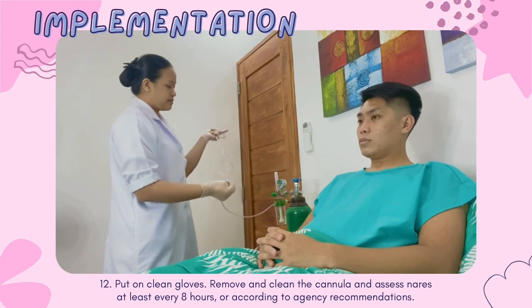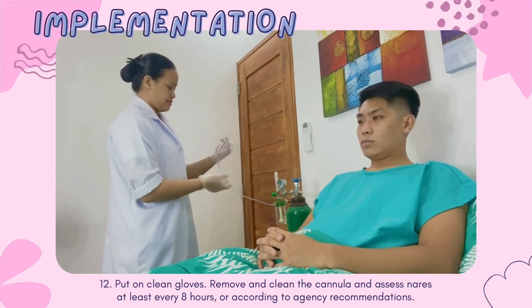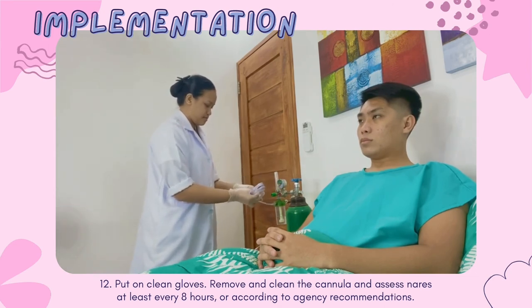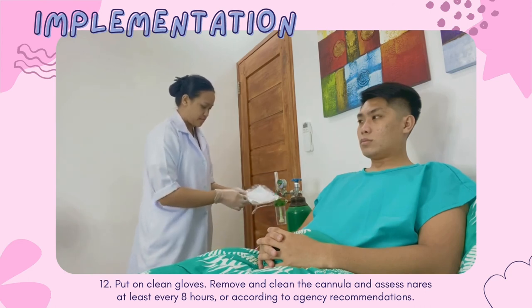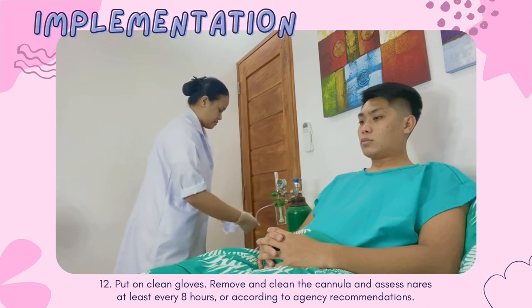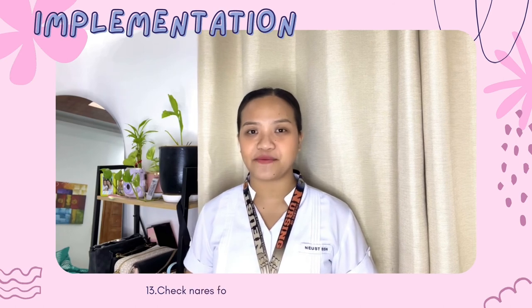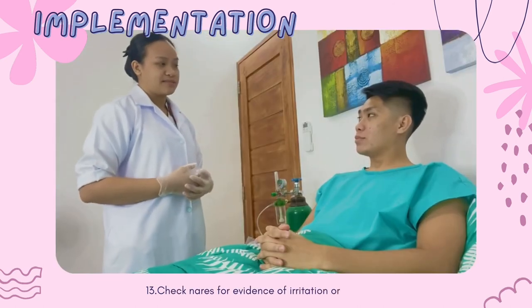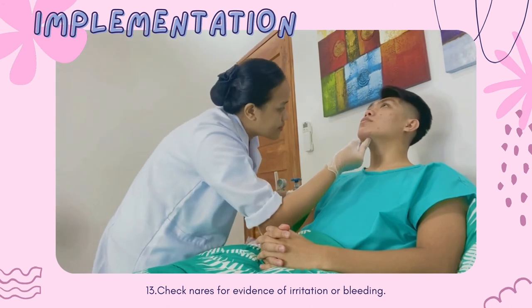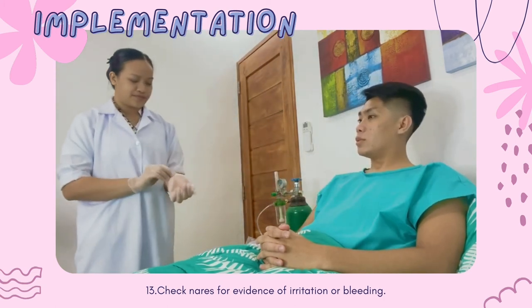Are you still having a hard time breathing? No. Okay, sir, that's good. Check nares for evidence of irritation or bleeding. Sir, I'll just check your nose if there's any bleeding and if you have any irritation, okay? Okay. So look up for me. Side. I think we're good, sir. Okay.